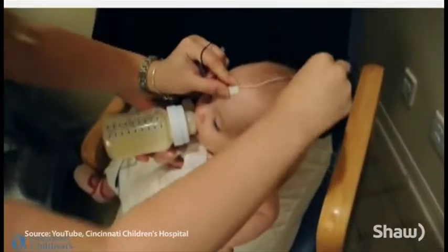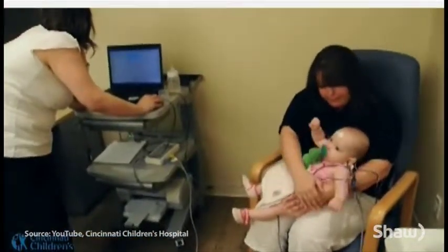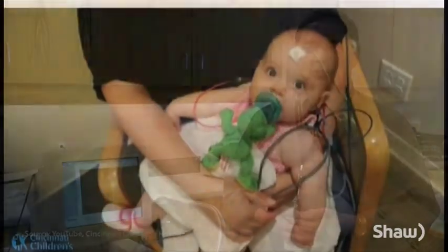One of the things about the new equipment that we'll have is it's pretty much the shape or size of a laptop with some accessory pieces, but it's very easy to just pick up in your hand and carry to the floors, up on peds or wherever we need to do this testing. It would actually allow us to do some testing at home if it's a situation where we couldn't bring the child in. So there's a lot more flexibility that way. And this newer equipment, again, isn't bothered by electrical activity near as much that might be going on in the room. And so you can be a lot closer to your patient and still do the testing.